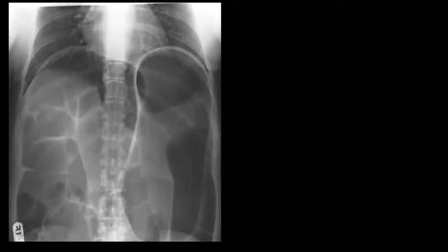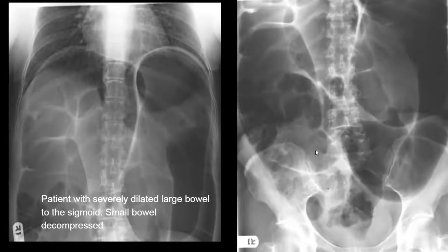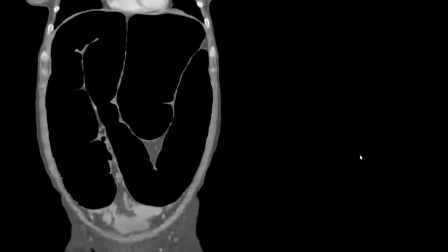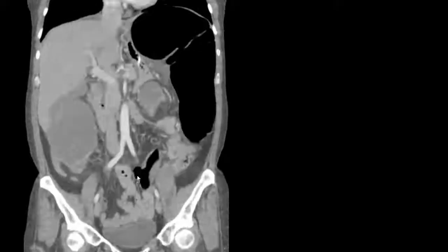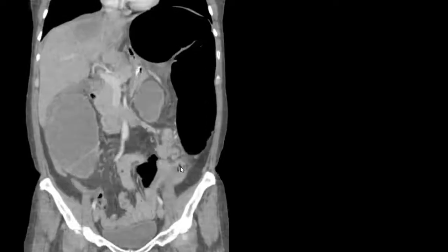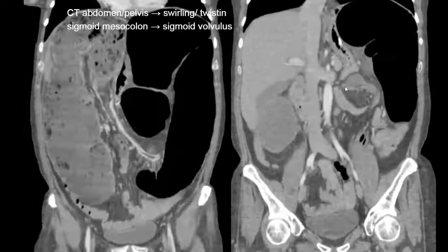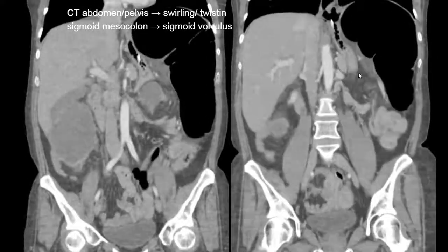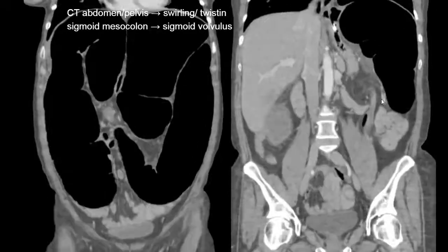Here's another example of an abnormal radiograph. Two radiograph images demonstrate markedly abnormally distended colon. Remember, the colon is much larger in caliber compared to small bowel, and we see this loop-like appearance. CT abdomen and pelvis shows a markedly dilated sigmoid colon that has twisted on itself — you can appreciate the swirl where the sigmoid mesocolon twisted on itself. This is an example of a sigmoid volvulus.